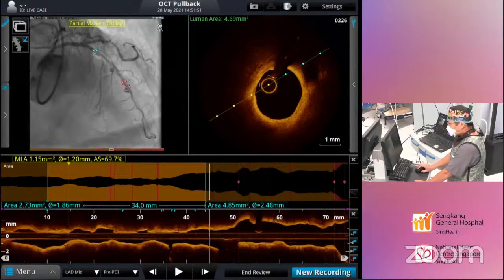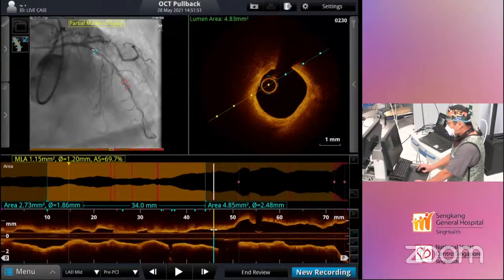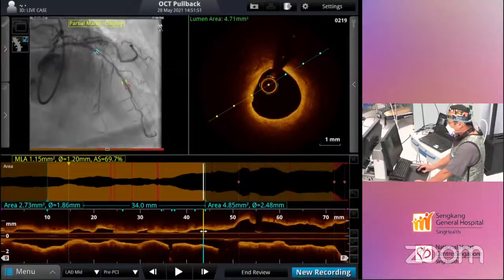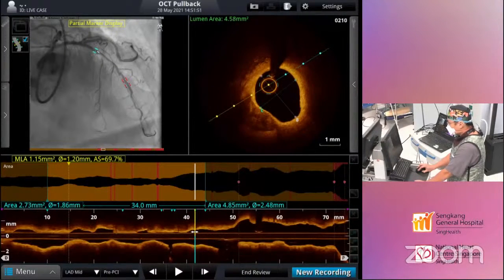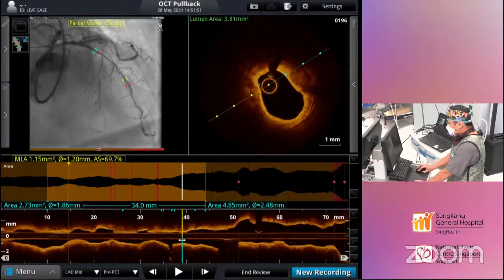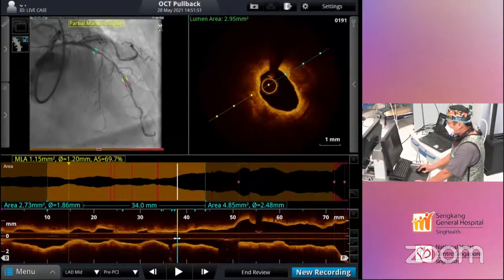And as you can see, the white marker here in the angio-reg tells us where we are looking. And here is roundabout where the lesion begins. We can see some calcification here at the 7 o'clock position. As we go further down, we see more bits of calcium here and there. Calcium on OCT has already been shown as a low intensity signal with well demarcated edges.